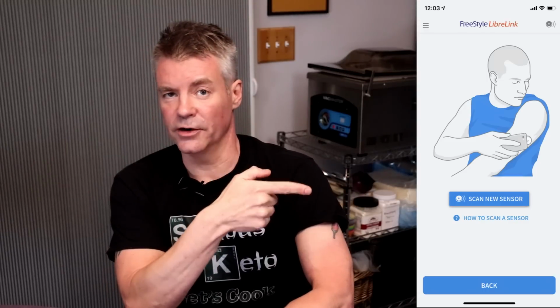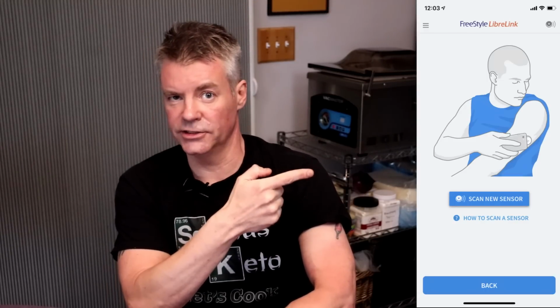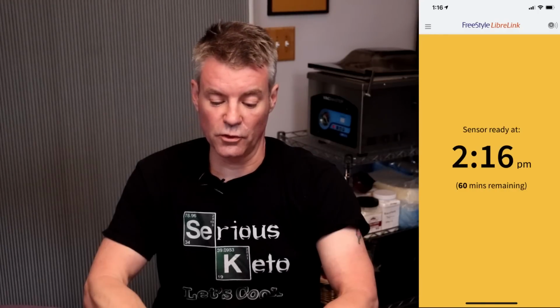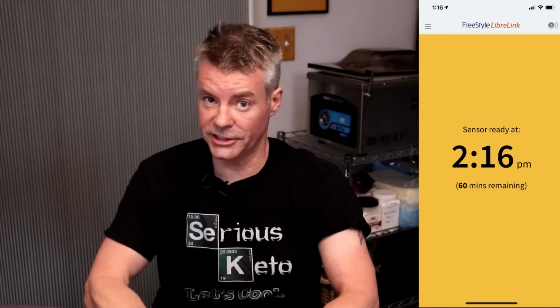Then we take our phone, open the Libre Link software, and you'll see right over here that it recognizes that I've put on a new sensor already. So we will hit Scan New Sensor. And we get a notice that says our sensor will be ready in an hour. That'll be 2:16 p.m.